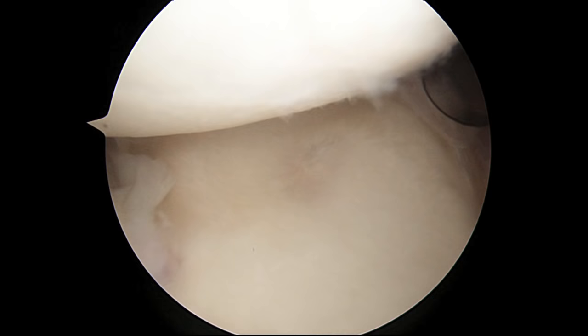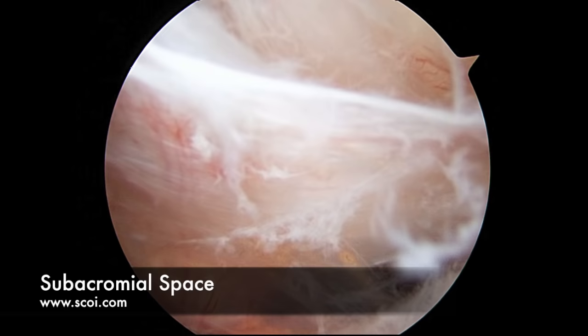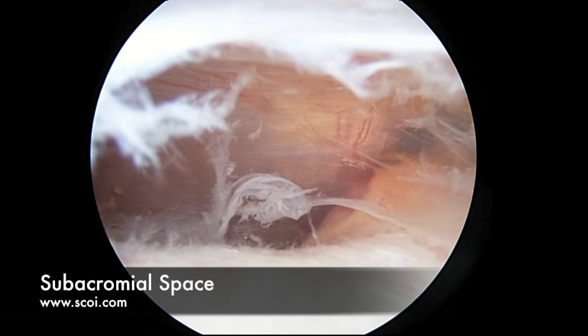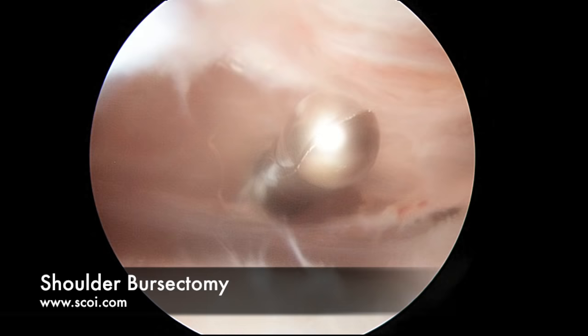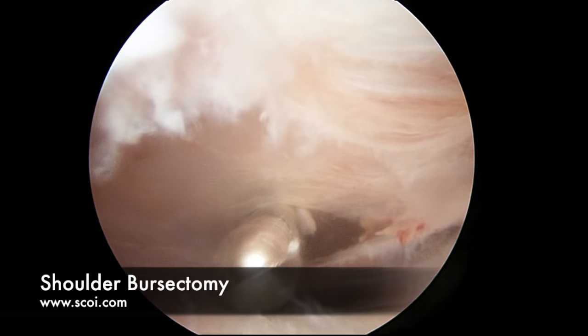The next step in a diagnostic arthroscopy is to look into the bursal space or the subacromial space of the shoulder. It is up one level on the top side of the rotator cuff, so we move the scope up and into the subacromial space. Now the rotator cuff tendons are down below and there is bone up above. Often times people can have bone spurring on the acromion and require removal of that bone spur to free up impingement syndrome on the rotator cuff. In this patient we are going to remove some of the subacromial bursitis. This wispy cobwebby type material is what bursitis looks like — it develops as a result of irritation in the shoulder. We can remove it and the shoulder will feel better, though it can return if there is a new injury.